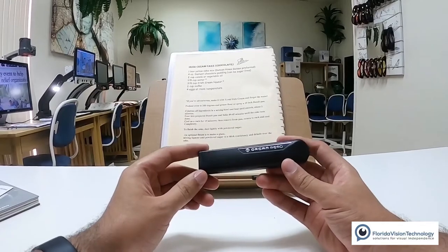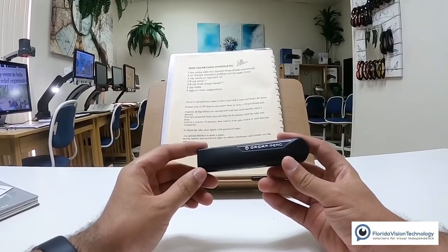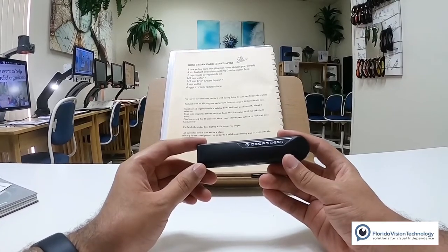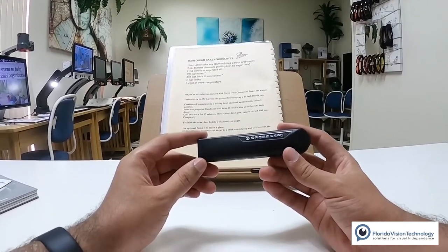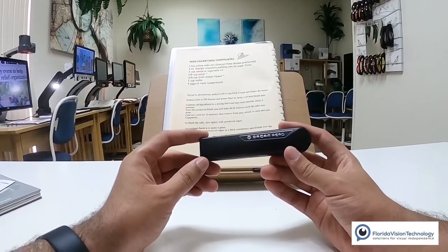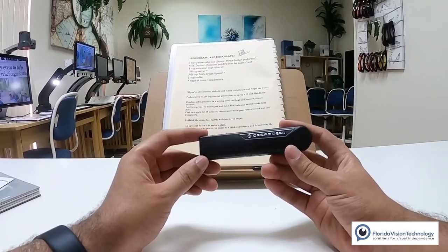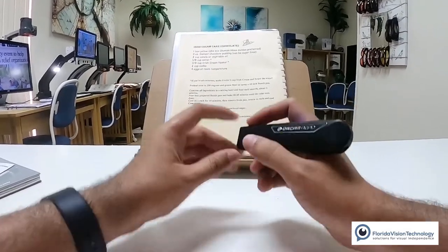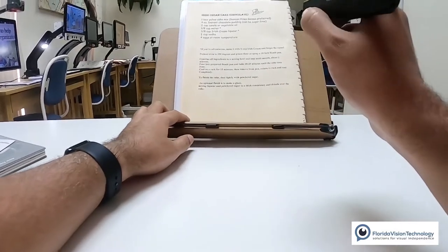One of the really cool features with the OrCam Read is a feature called interactive reading. I'm going to activate the voice command feature and say 'start reading' — it's going to take a picture of the text, and I can then give it different voice commands like 'read everything' to read all the text it captured, 'read telephone numbers', 'read amount', 'find specific text', or 'read headings.' Let's check it out — I'll hold it about a foot away and double-press that trigger button.